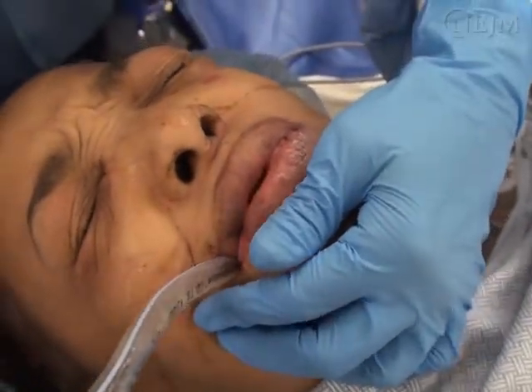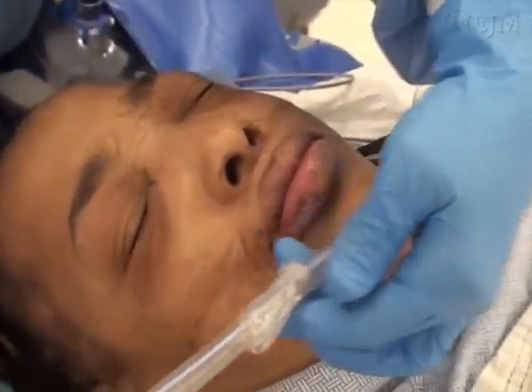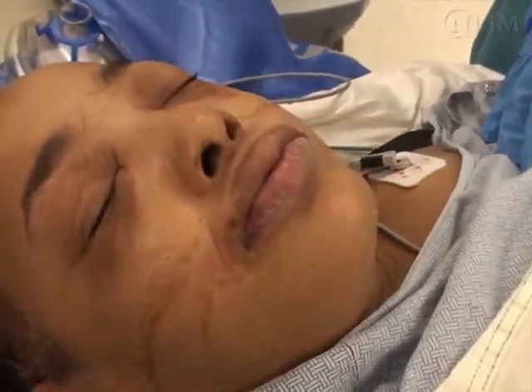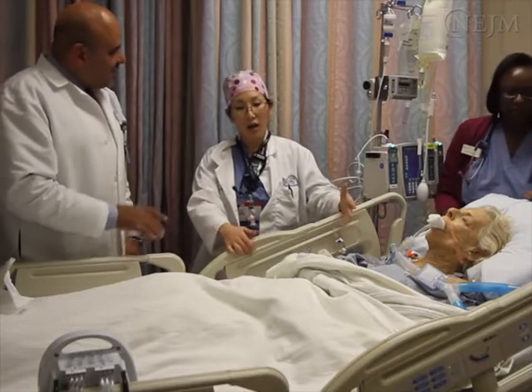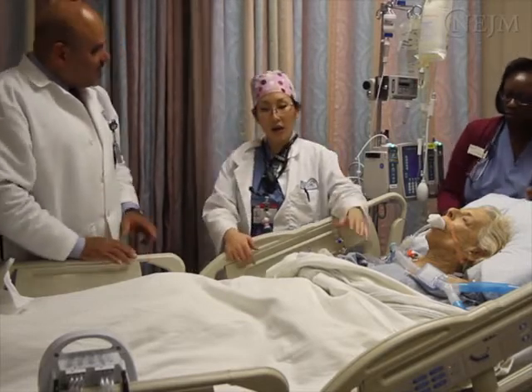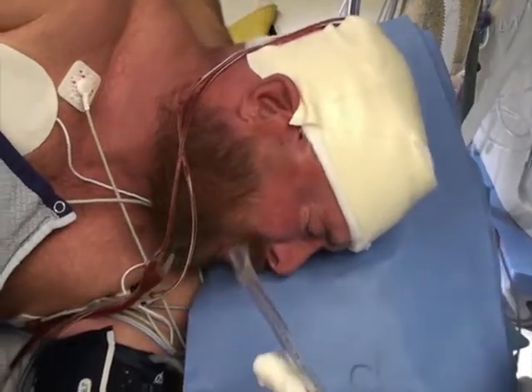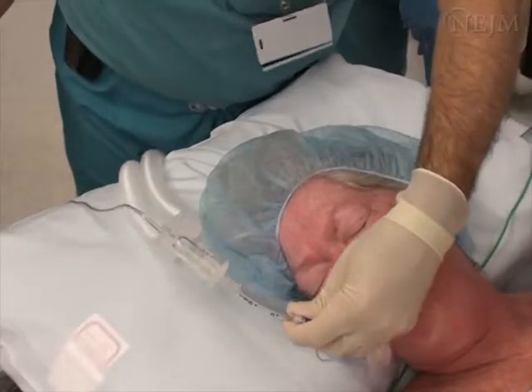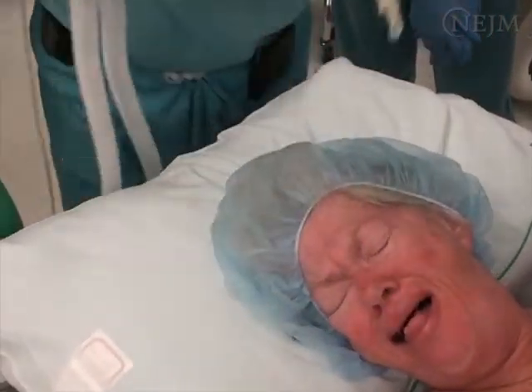Endotracheal extubation refers to the removal of an endotracheal tube from the trachea. This procedure is commonly performed in operating rooms, post-anesthesia care units, and intensive care units. This video focuses on extubation of the trachea following general anesthesia and short-term intubation. The many considerations required for extubation following long-term intubations are beyond the scope of this video.